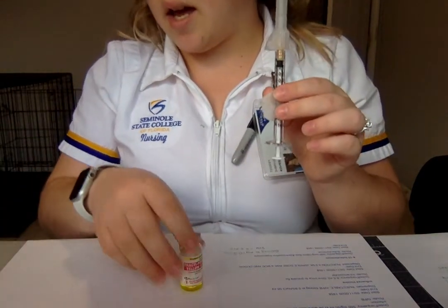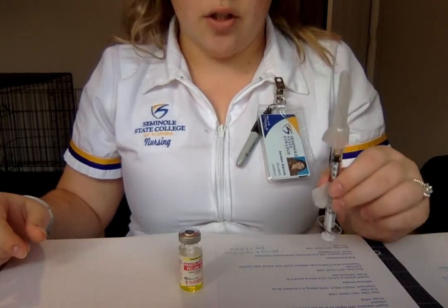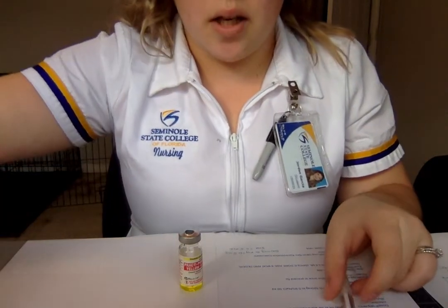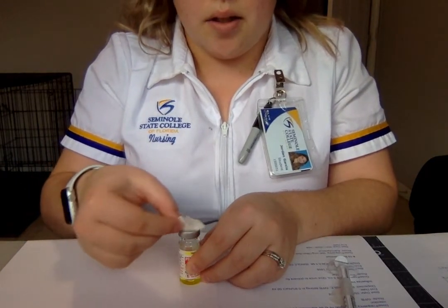Now I'm going to go ahead and draw up my second one, my subcutaneous vitamin B12. So for that one, I have the 25 gauge needle and my 1 ml syringe. Same thing for this one. I'm going to cleanse the top of the cap.